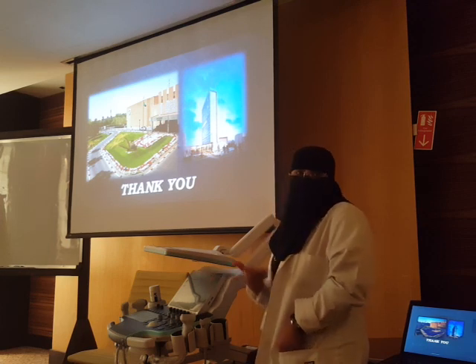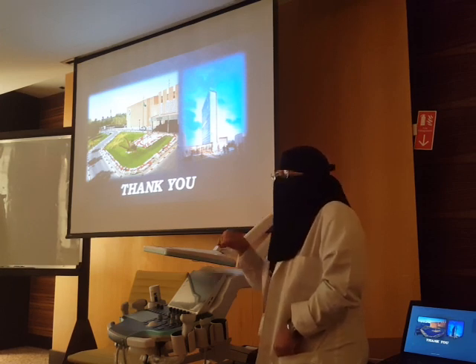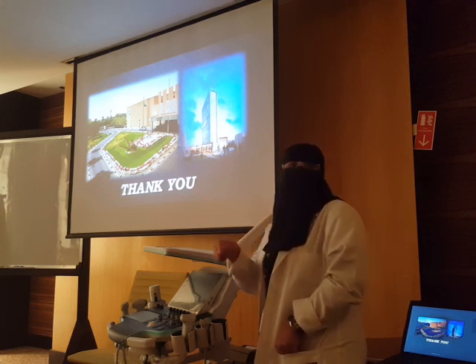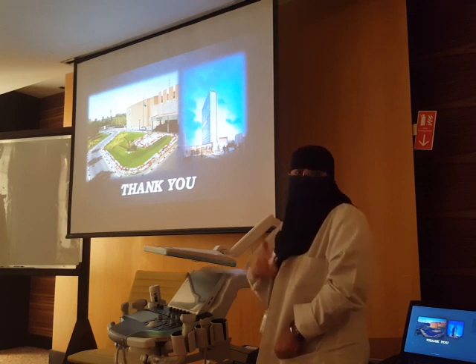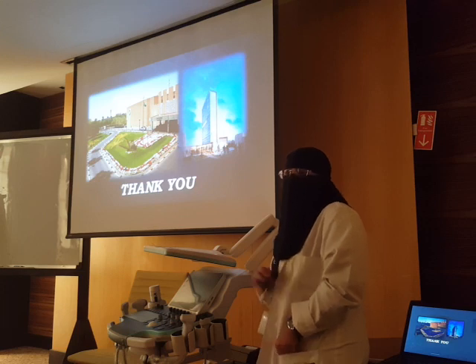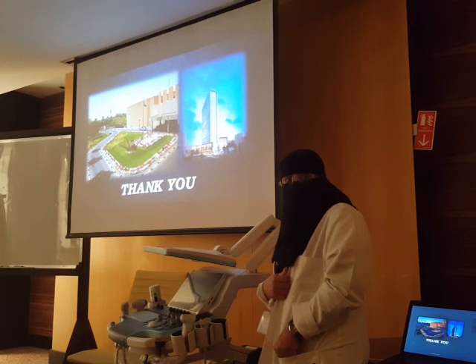If it's the body habitus, in the pediatric, it's not like the adult, we can manage. Even sometimes we need to compress, and they will be facing you while you compress and will scream more. So you sedate him, distract him. This is the only solution. But in the pediatric, there is no big limitation.